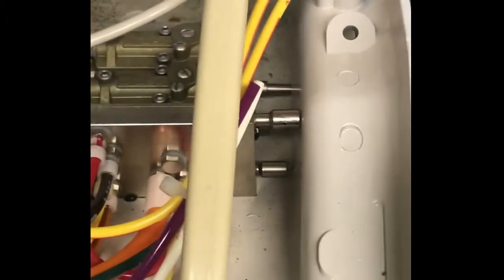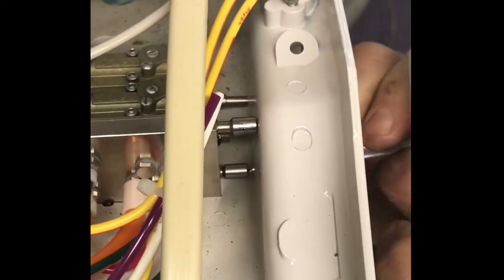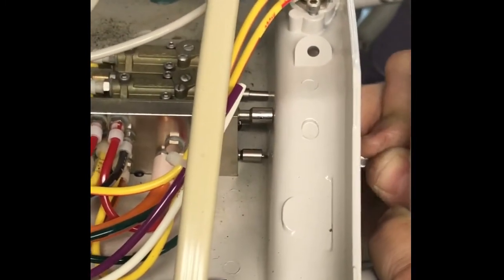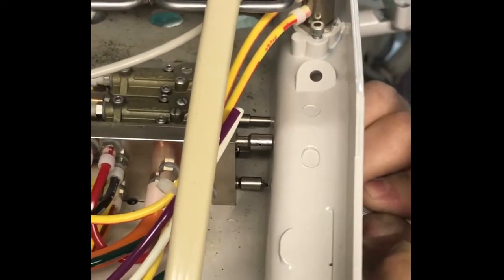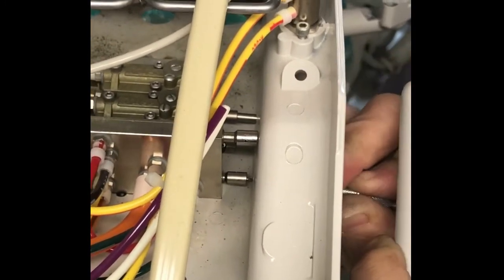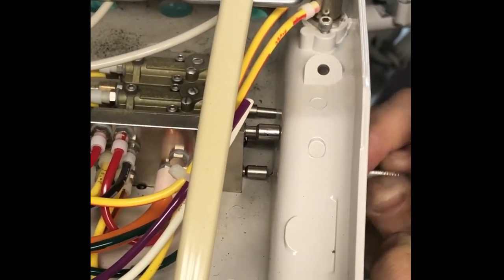I'm going to do it without light here. And we'll fish around until that sucker comes out, because I think this literally might be the hardest part of the whole thing, getting the O-ring out. I might not have given myself enough light here. I believe in what I'm doing though, so we'll dig around until that O-ring comes out. I maybe was a little bit too confident here. Oh, here it comes. All right, so I just dug around until that O-ring started to come out, and now I almost got it.